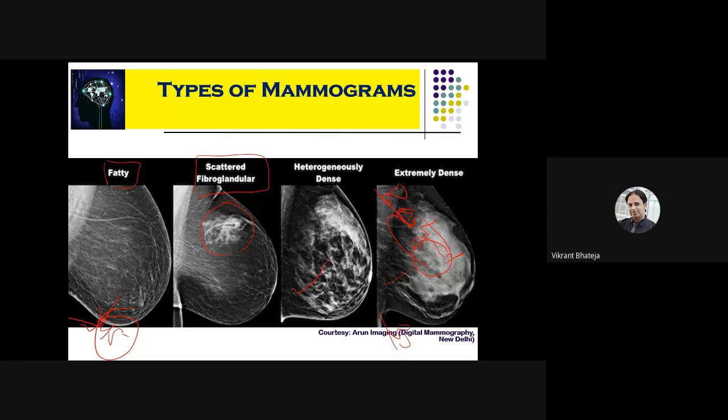But at later stages, as the lady moves through different phases of age, the density of the tissue starts getting thin. Once the tissue density starts getting thin, there is more chance to view the tumor.